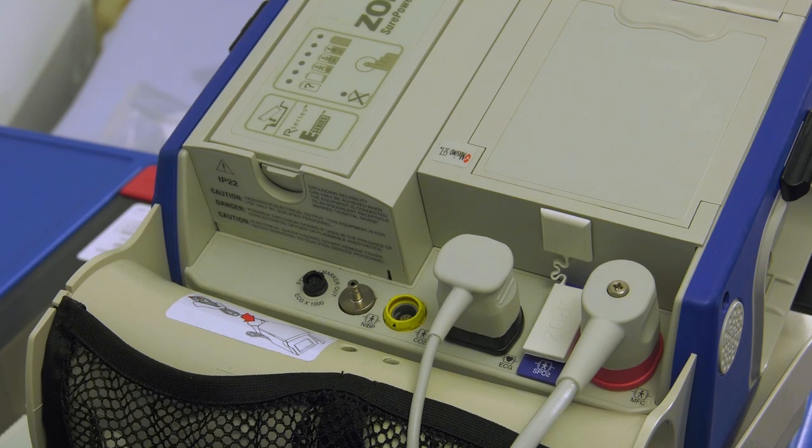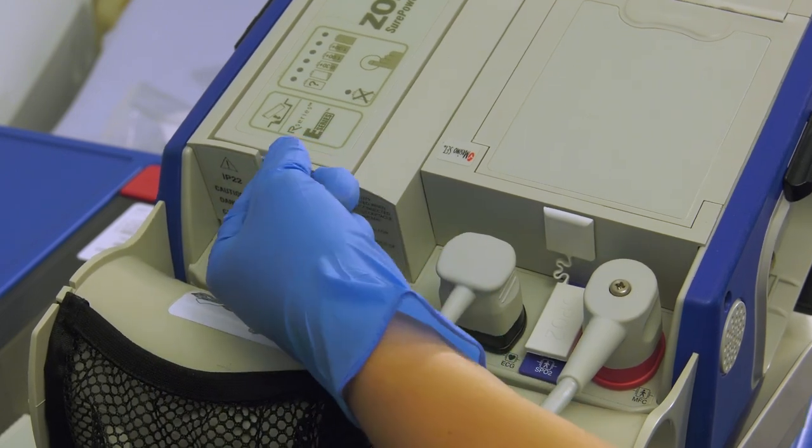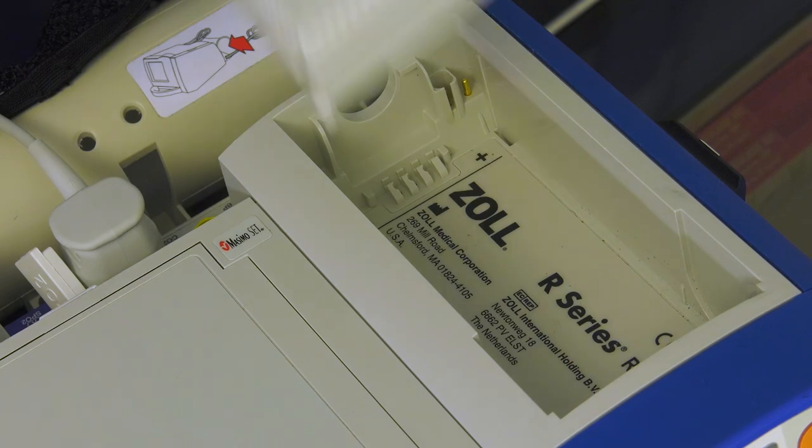In the event you need to change a battery, simply press the release latch and pull up. Then snap the new battery into place.